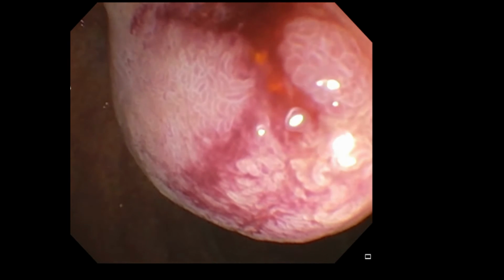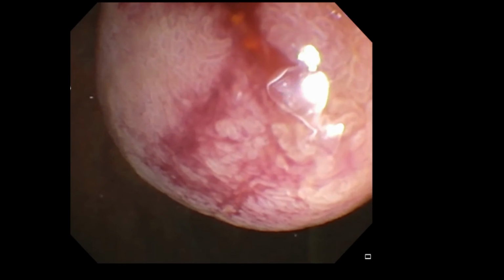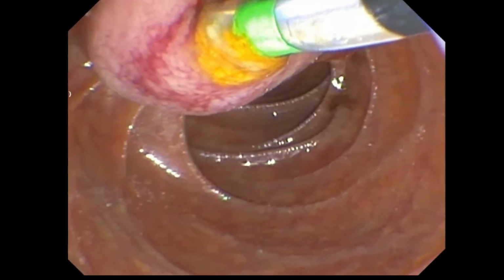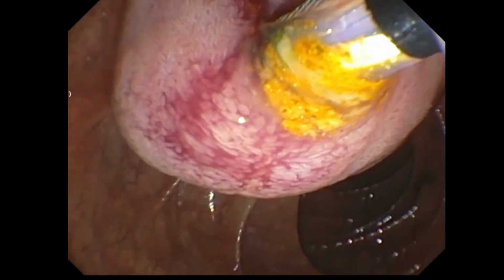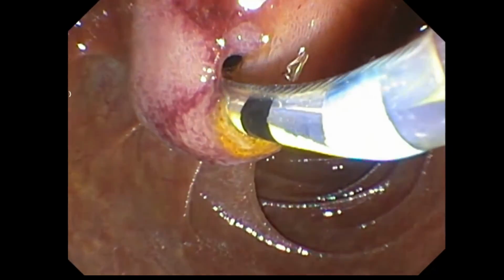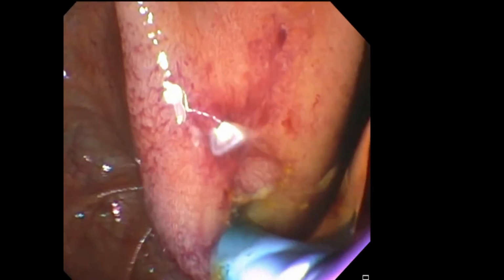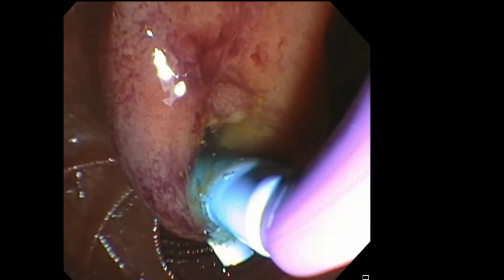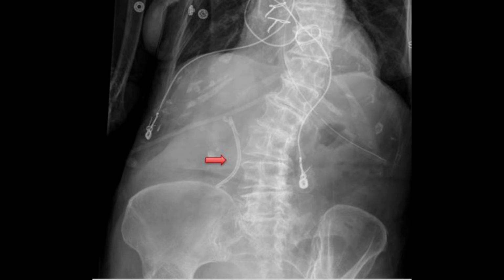Therapeutic duodenoscope was used, which showed a bulging ampulla in the second part of the duodenum. The bulging major papilla was engaged with the sphincterotome, expressing sludge and debris. The guide wire was passed into the bile duct and the sphincterotome was used to cannulate the bile duct over the guide wire. A sphincterotomy was performed and the sphincterotome was removed over the guide wire. A 10 French by 7 cm plastic stent was placed 6 cm into the common bile duct. Stent position was then verified using an abdominal radiograph. There were no immediate procedure-related complications.